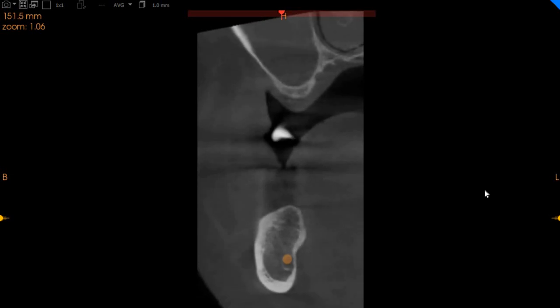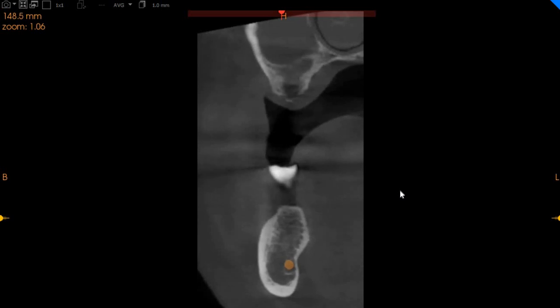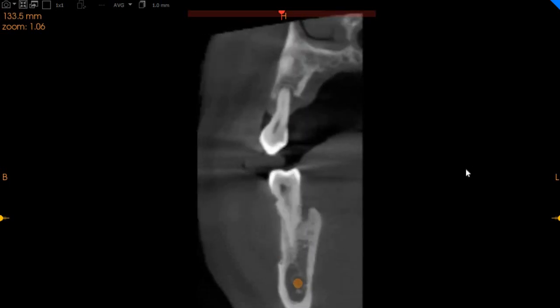Moving to the lower left 7, good ridge. You've got D3 bone quality. 11 millimeters of ridge width with approximately 10 millimeters of height. Moving to the region of the lower left 6. The lower left 6 again suffering from bone loss, but not as significant as the uppers. This tooth, if periodontally cleaned, if therapy is done, this tooth can be restored and can be sustained.